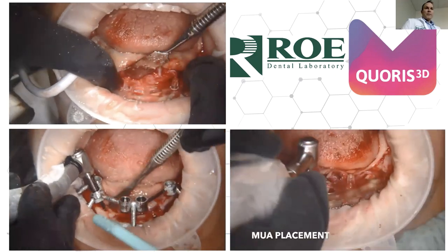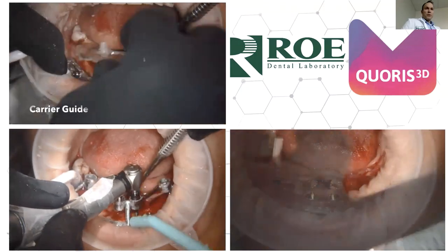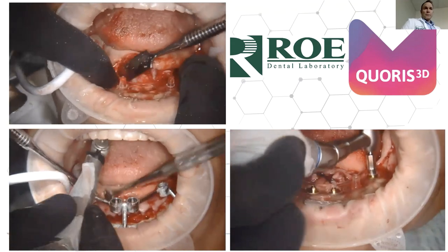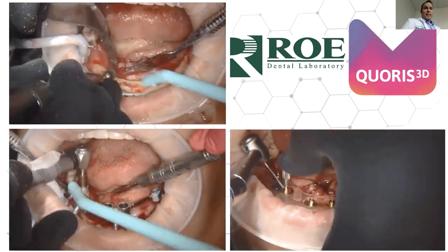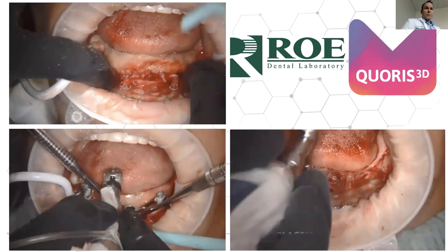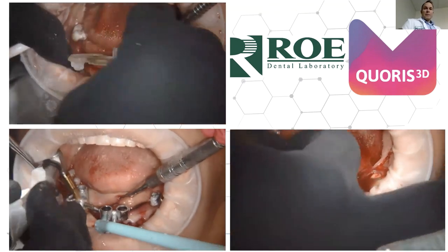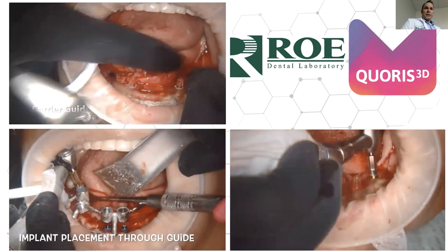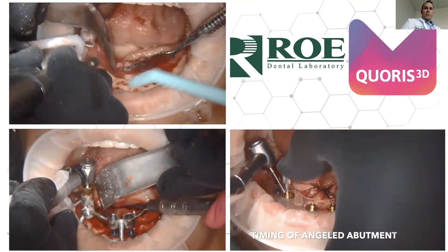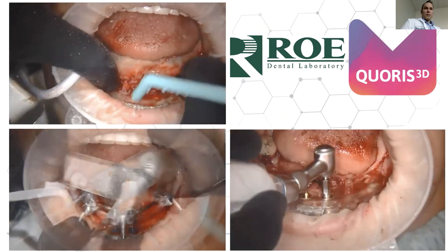The bottom left is the osteotomy guide. This particular system shown is a Megagen system — there are no spoons, just a drill placed through the osteotomy guide. Megagen and MIS both have drills with large hubs that meet the inside of our osteotomy guide. Most other systems have a spoon system. On the right, the carrier guide is placed after the implants are in, and is used to orient and place the multi-unit abutments in the right orientation, indexed to the implant.